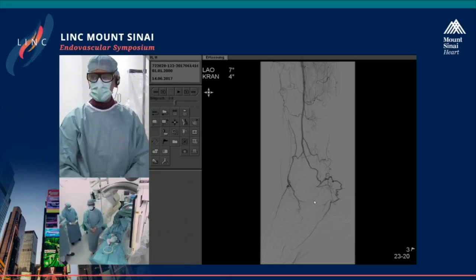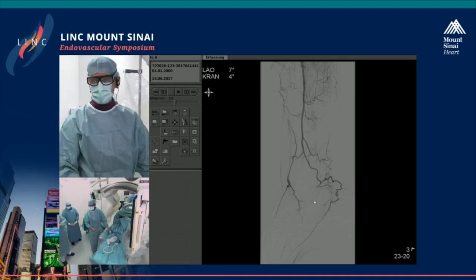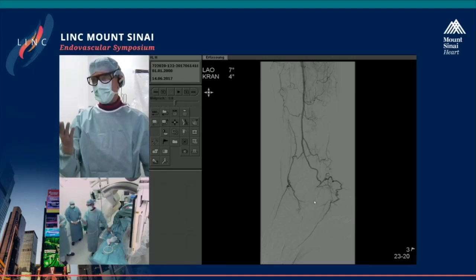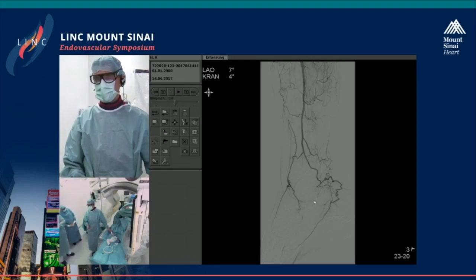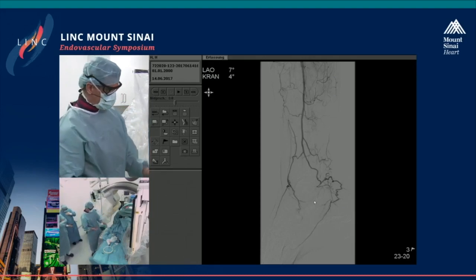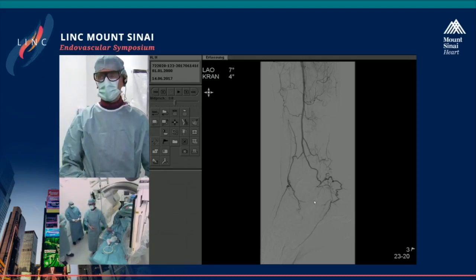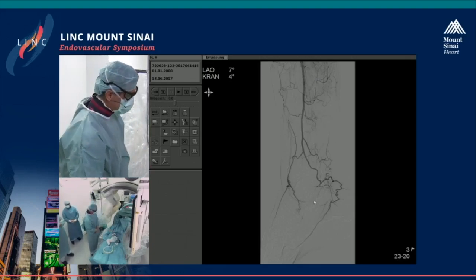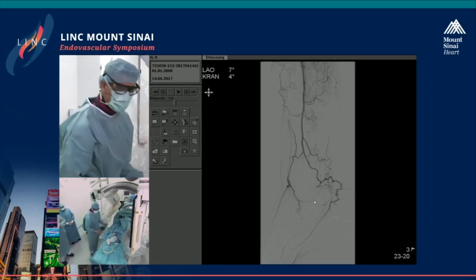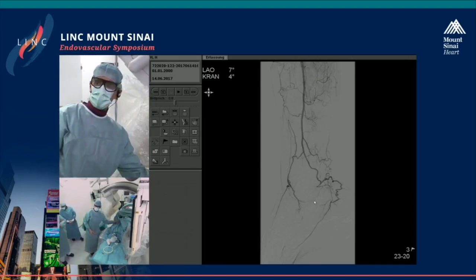And we want to take a pedal sheath in. Usually we do peroneal access without a sheath, just a support catheter, but this artery is also very strong, and in fact, we have never seen any problems with a pedal sheath from retrograde, neither in dorsalis pedis or posterior. So I think it's also a safe way to access the peroneal artery. Not sure whether you can really see this very well on the camera.